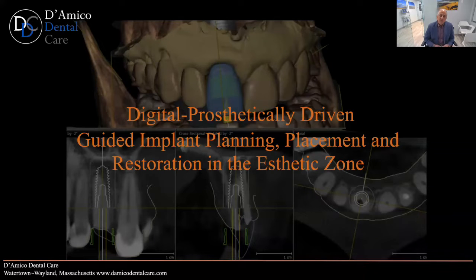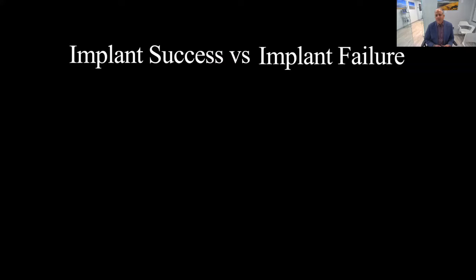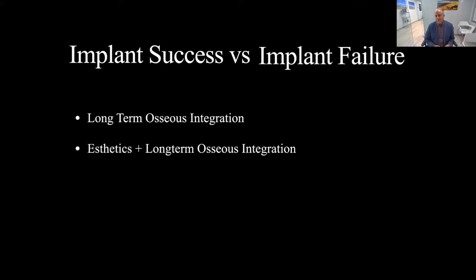So what I hope to do tonight is really just kind of share with you my enthusiasm for CAD/CAM dentistry and digital dentistry, and specifically to guided implant planning, placement, and restoration in the aesthetic zone. So if we look at implant success versus implant failure, and I show you this case coming up, what I want you to think about is implant success or failure, is it long-term osseous integration? Is it aesthetics and long-term osseous integration? And I think our practices, and mine really has evolved into the point where I look at an implant success, aesthetics and long-term osseous integration.